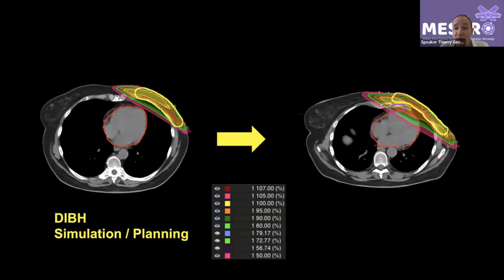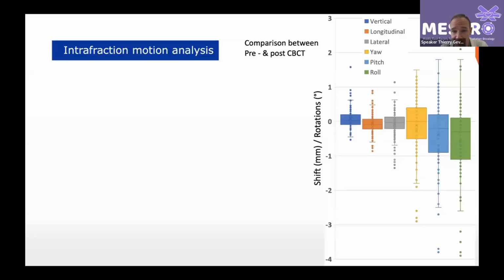If the patient is not reproducing that breath-hold at the time of treatment, you see that the heart can be at another position, and maybe the dose will be delivered to the heart and not against the heart. So the breath-hold stability is really important, and that's something new for us, and we can add some new information and move ahead to have patient-tailored treatments.